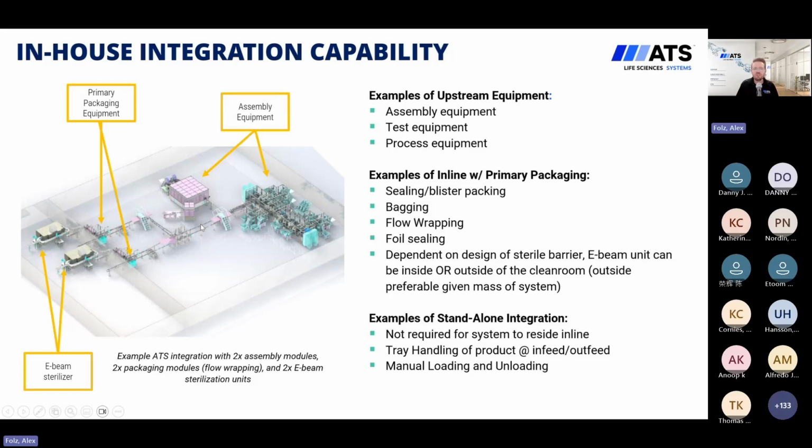I think one other important note to see on this image here is that depending upon the design of the sterile barrier, one exciting part is that the e-beam unit can be inside or outside of the clean room. So in the example here, you can see that we've placed it outside of the clean room. Imagine this wall here is the wall from the clean room over here to, on the bottom, a docking bay area. So, the system does have a relatively large amount of mass associated with it, right? So we know that based on that, we would prefer it to be outside of the clean room here, but both options are available should you not be comfortable putting the device outside of the clean room after the sterile barrier is closed here.